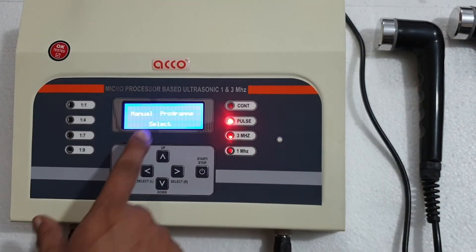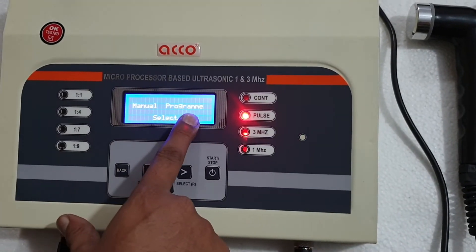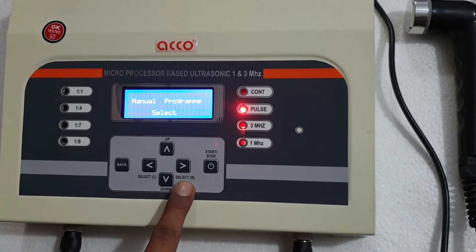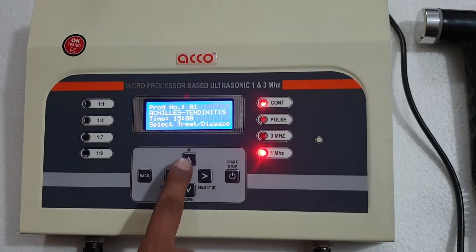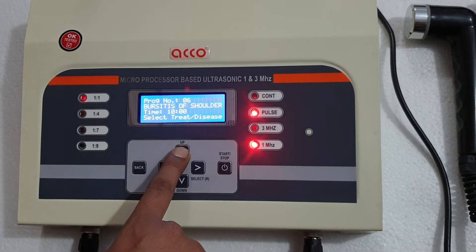When you switch on the machine, it shows manual and program. It has inbuilt programs and you can also set a manual program as per your requirement. To select programs, select the right button. From here you can see the program numbers: Program 1, 2, 3, 4.